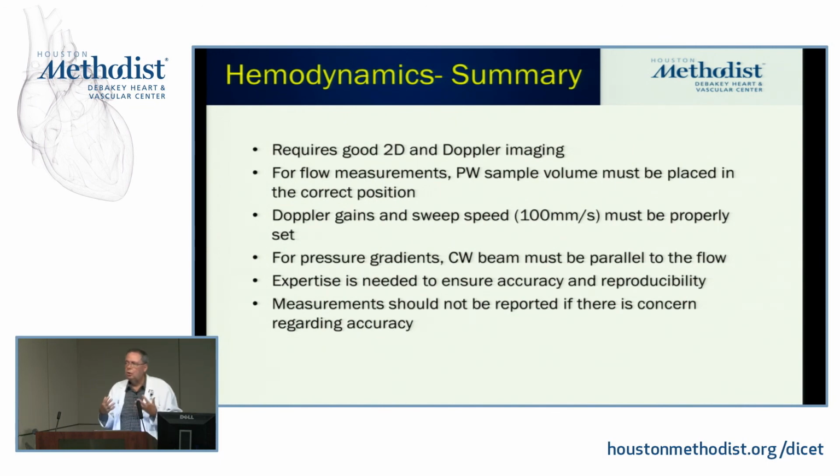Please do not say "inadequate TR velocity, PA systolic pressure is at least 22." What have you told the doctor with that? What is the clinician taking care of the patient going to do with that data? You're telling him, I have trashy data, and yeah, the patient is at least alive. I mean, the PA is at least normal. Is that helping me any?